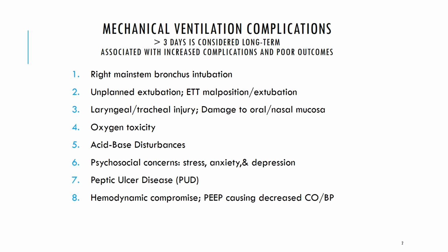Why? We're talking about the lungs, not the heart. But remember, we are not using the normal negative pressure ventilation we're used to. We're using positive pressure ventilation. We're pushing air into somebody's lungs. So you might recall that every time we give a patient a breath, we increase the intrathoracic pressure. So think about it. What else is in that intrathoracic cavity besides the lungs? It's the heart. So when we increase pressure to inflate the lungs, we increase the pressure up against the heart and around the heart.